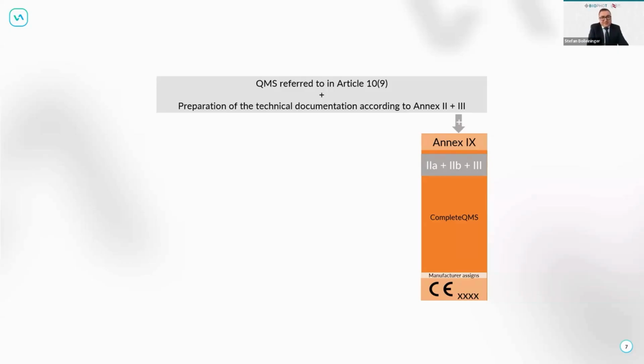If the physician uses that device without talking to the manufacturer and giving the manufacturer the information, and still uses it, so they do it at their own risk without giving information first, then this device will be in the so-called off-label use. That's not the problem of the manufacturer. That's a problem of the physician.